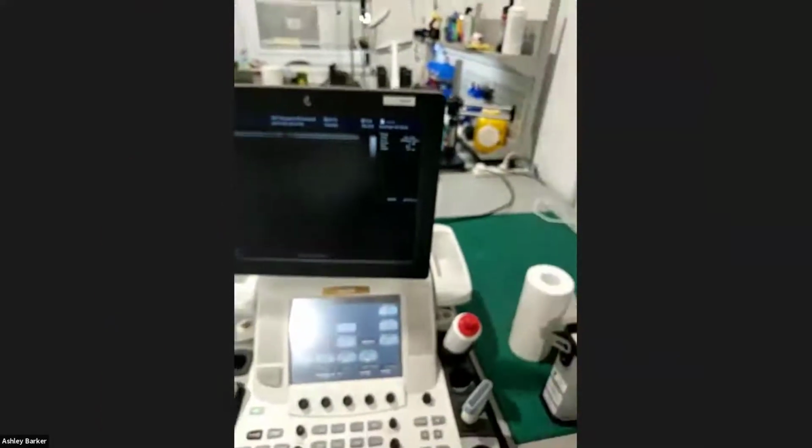One thing I've noticed over the years with the point of care machines, particularly if you're in the lucky situation of having more probes than you have connections to the machine, which isn't that often, is if you are disconnecting probes and putting other probes on multiple times, I've noticed quite a few times when you get dropout, sometimes it's just dust on the connector. Yes. And so first thing I do if I get dropout, which I hadn't seen before, is I disconnect it, I blow a few times on it and then reconnect it. And often I find it's dust. I don't know if you've noticed that.